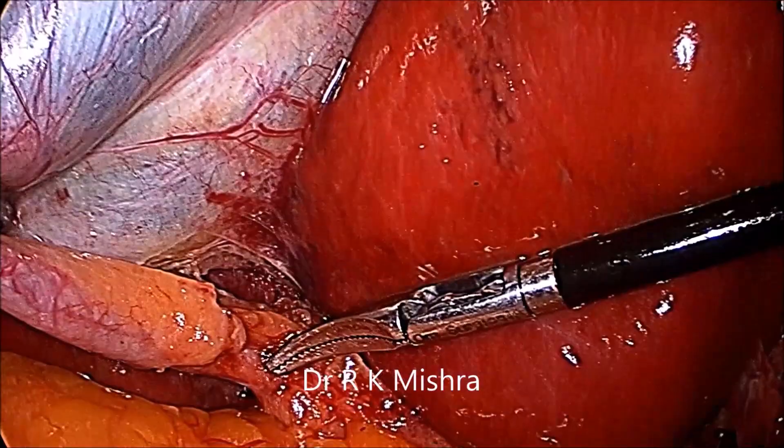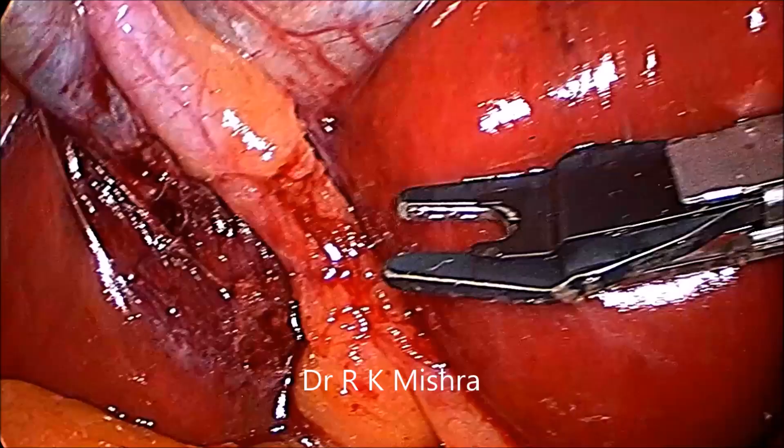Then you can take a Maryland and enlarge the posterior window by opening the jaw of the Maryland. And then you can make an anterior window in between the duct and artery.